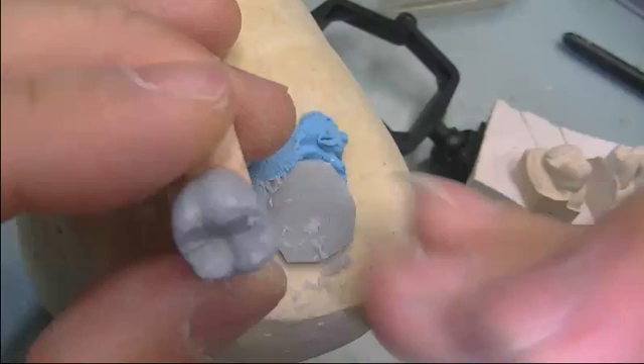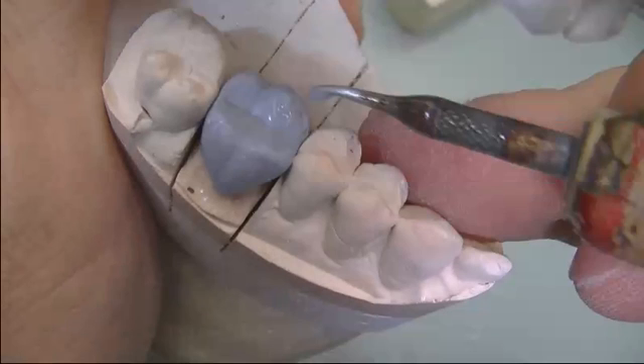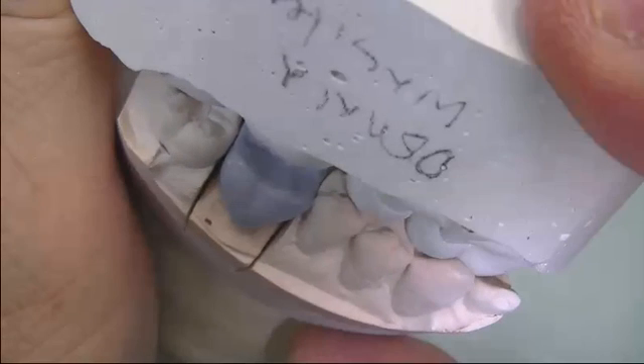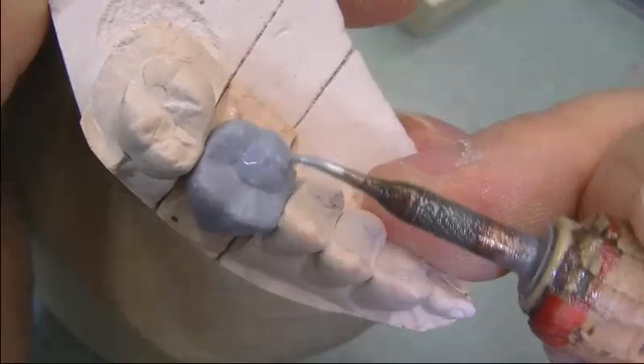Now we put the die back onto the model and check for occlusion. We're going to do a minimal addition, working on the mesial lingual cusp — keep adding until we get an indication mark, then smooth out so the cusp tip goes into occlusion with the opposing. We have to do the same on the other side.